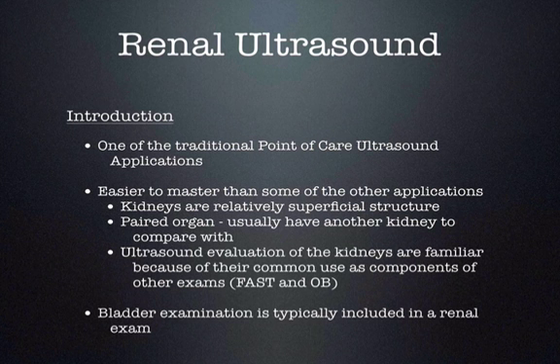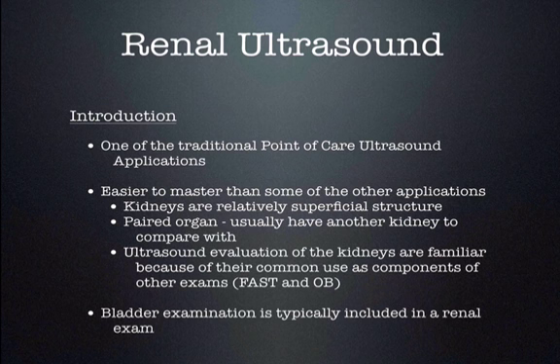Renal ultrasound is one of the traditional point-of-care applications which began to popularize the concept of bedside physician-performed and interpreted ultrasound. Compared to many of the other ultrasounds performed, it tends to be easier to master, largely because the kidneys are relatively superficial structures and thus less affected by artifacts caused by air, fatty tissue, and other surrounding structures. You also have the benefit of the kidneys being paired organs, allowing you to compare an abnormal appearing kidney to the other side. Lastly, the renal ultrasound exam becomes very familiar because it is incorporated into many other point-of-care examinations.